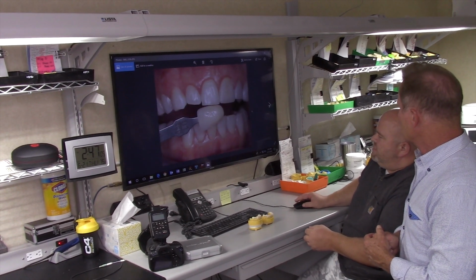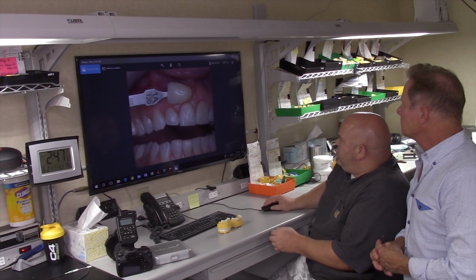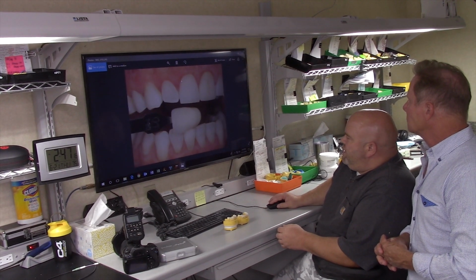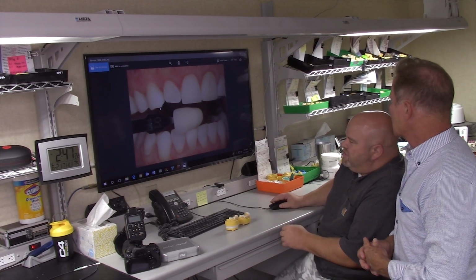One of the interesting factors here, when you have the flash, it captures the line angles, which is valuable too. But when you go to the polarized photos, it cancels that out, so we can actually see what's going on in the interproximal areas color-wise, where it's all washed out with the flash.